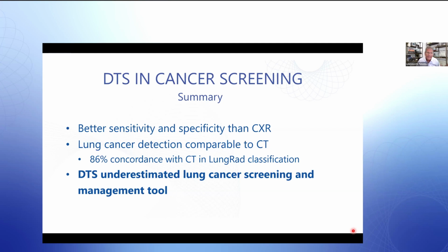But clearly we are looking at a tool that takes you beyond the chest X-ray, offers comparable lung cancer detection to CT, dictates the next steps and what needs to be done roughly the same way that CT does, and that along with chest X-ray, digital tomosynthesis is a vastly underestimated tool for lung cancer screening and management.